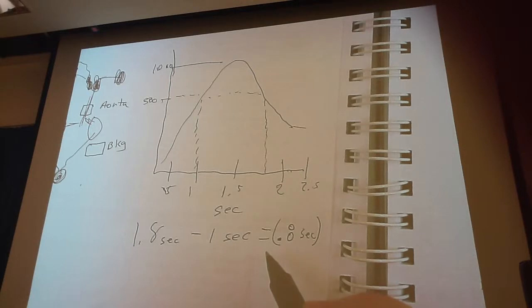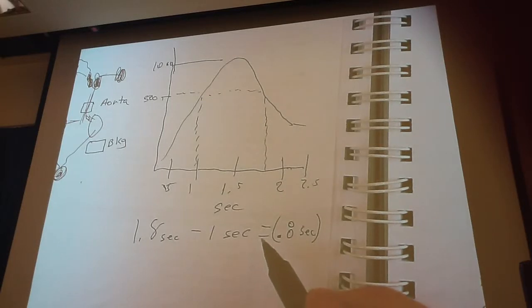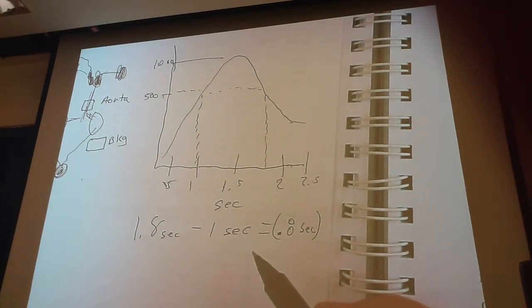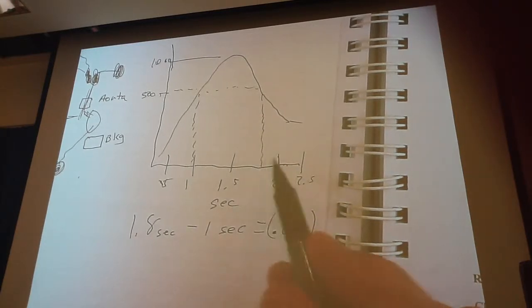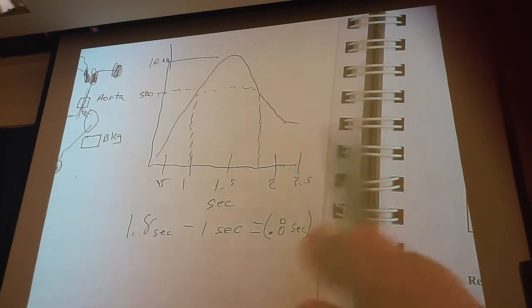If it's over 3 seconds, then that means your bolus is not good. You took too long. Okay? A bolus should be a very tight, small concentration, high activity, arriving in a short period of time, less than 3 seconds. Okay? This is how you calculate it. We do it for heart studies, we do it for any type of flow studies.